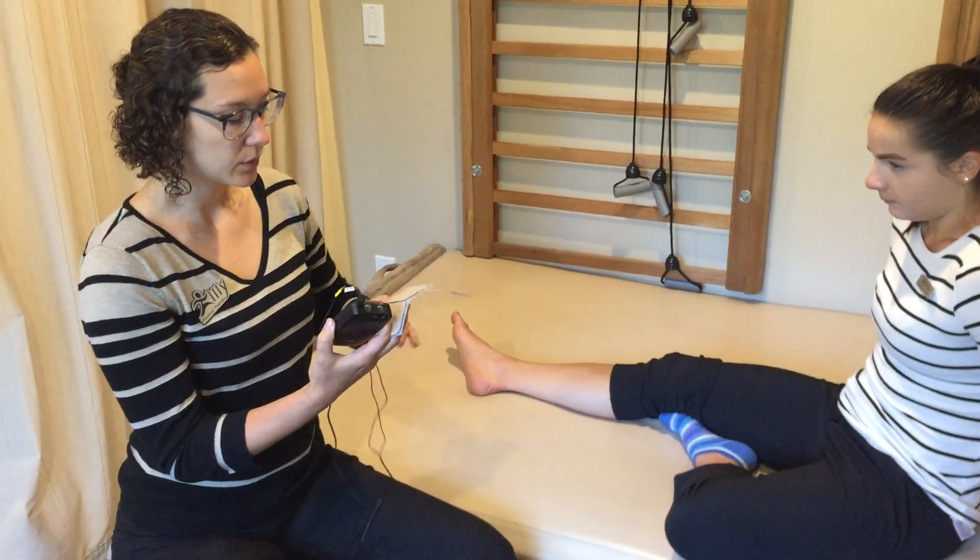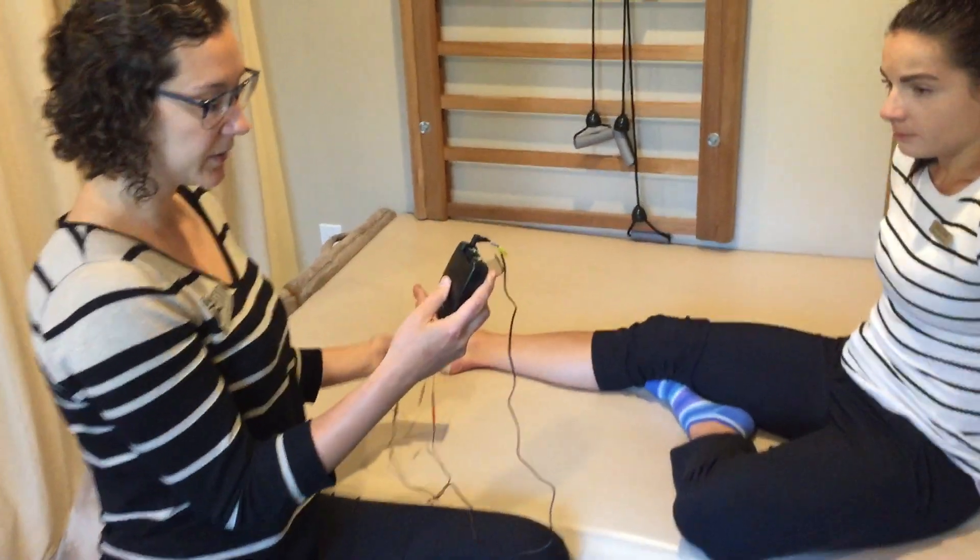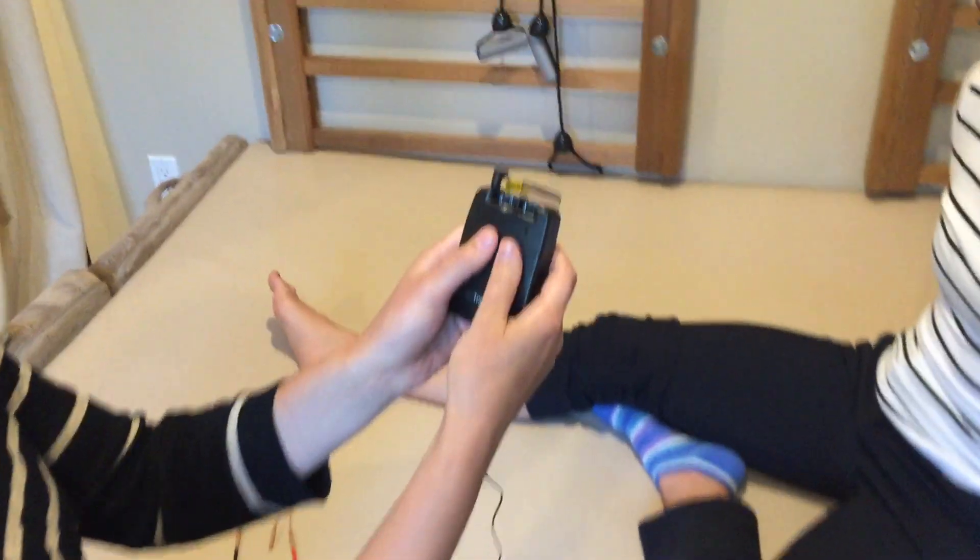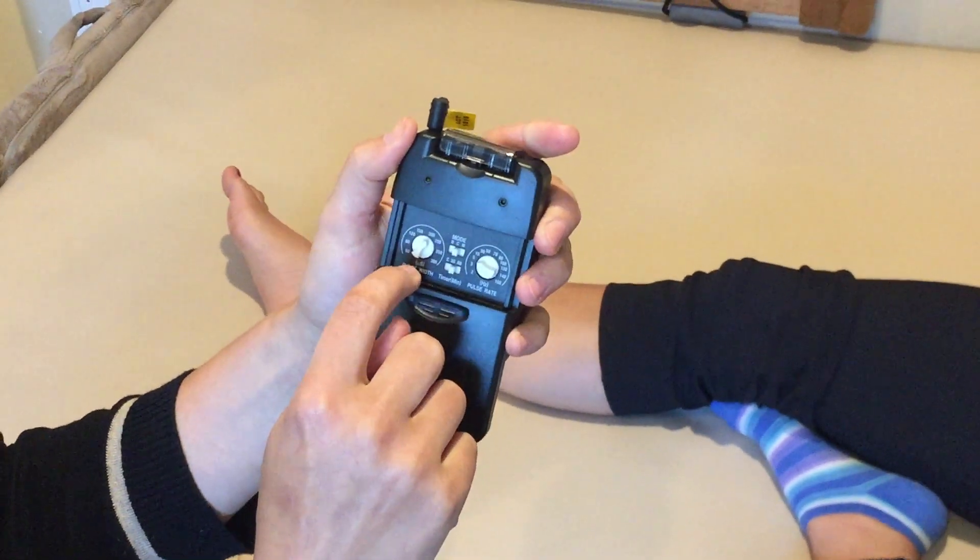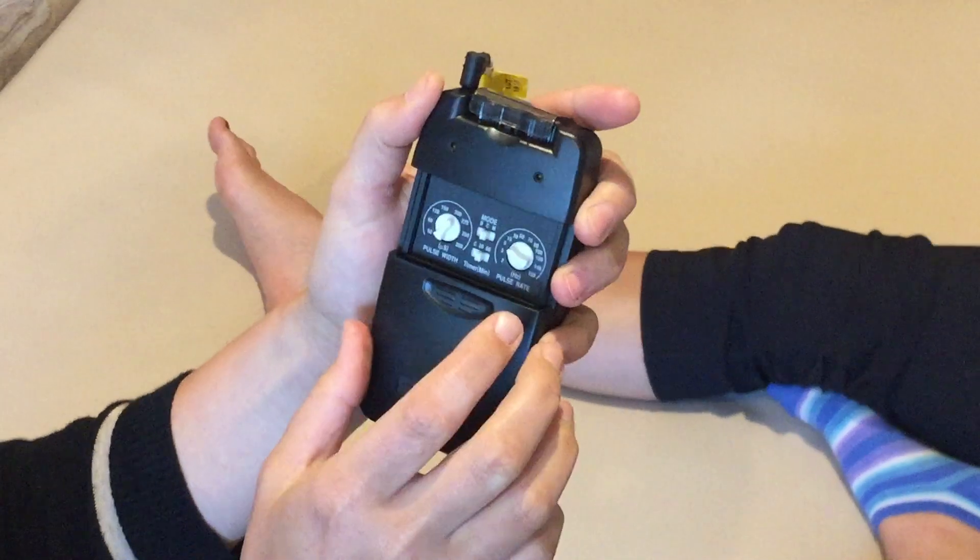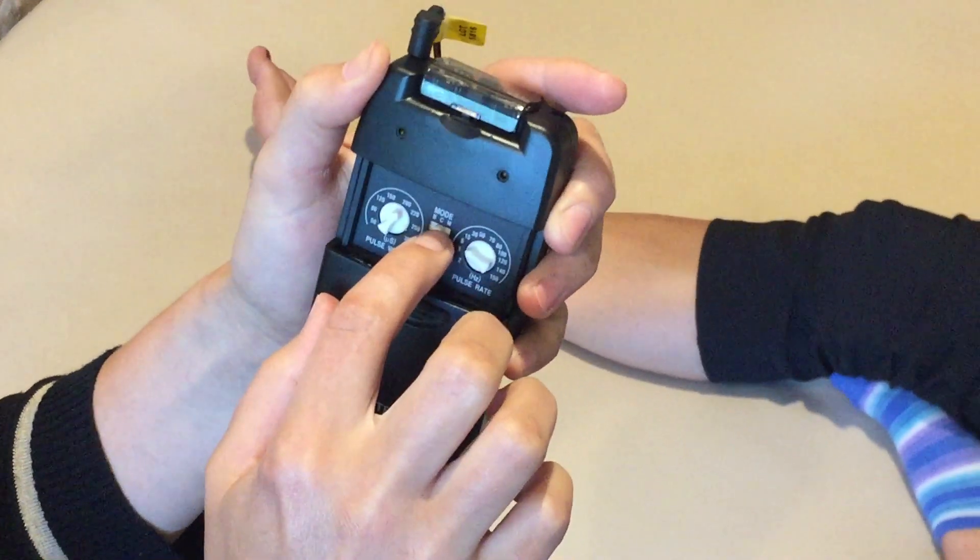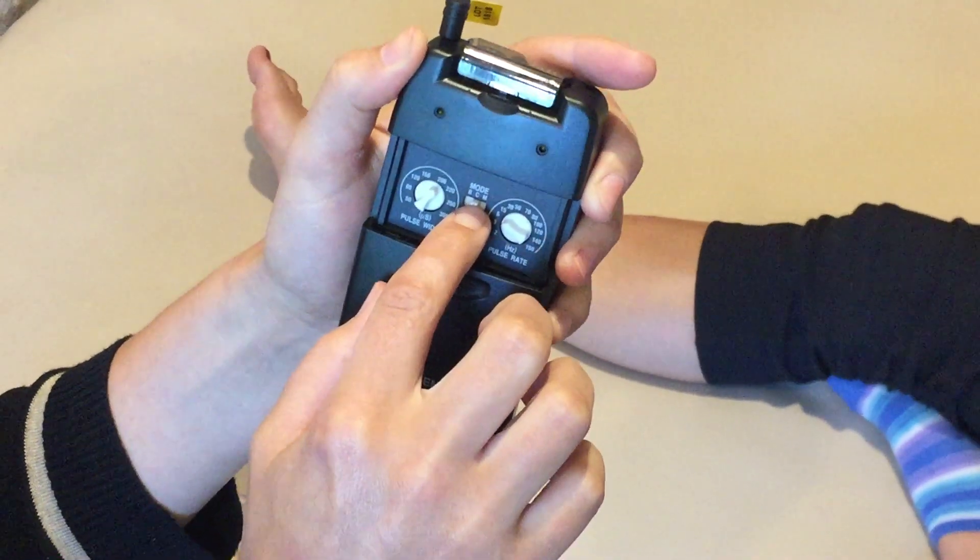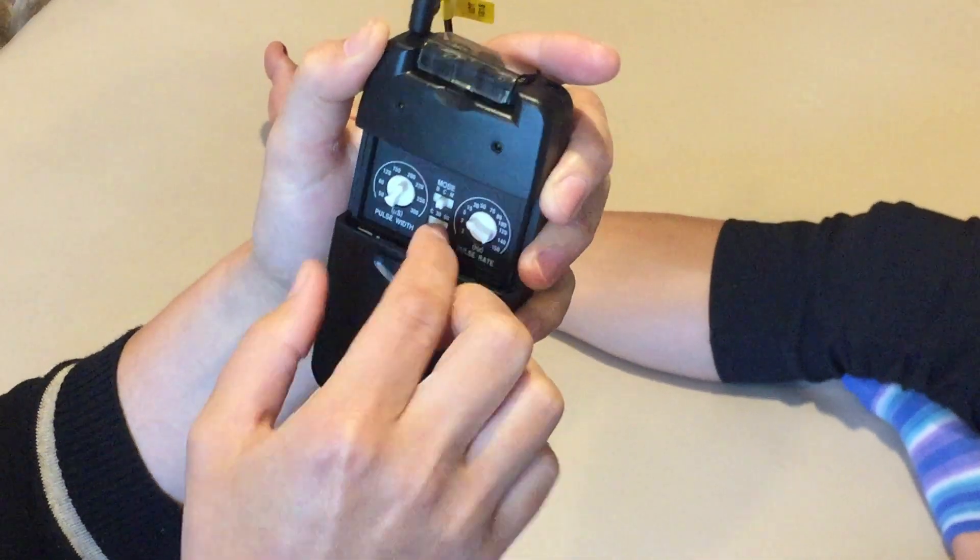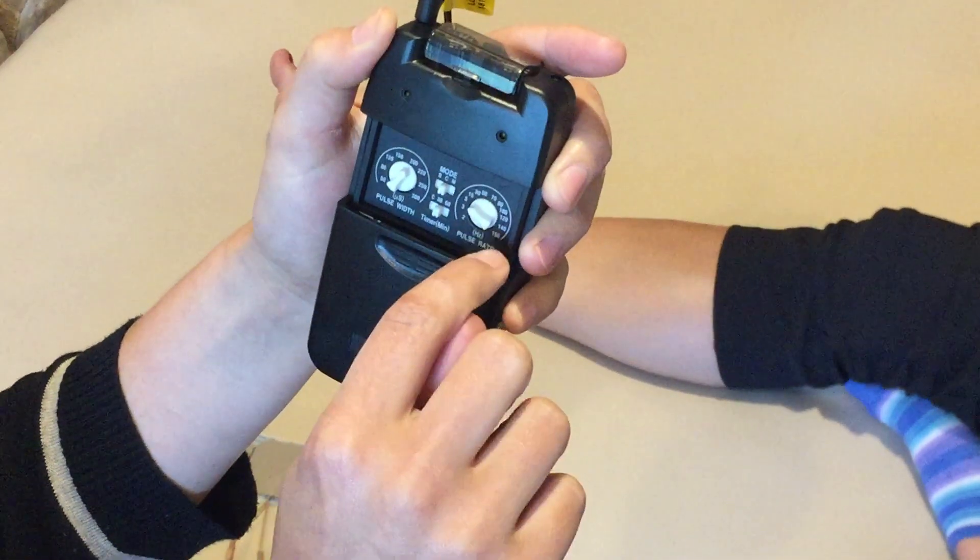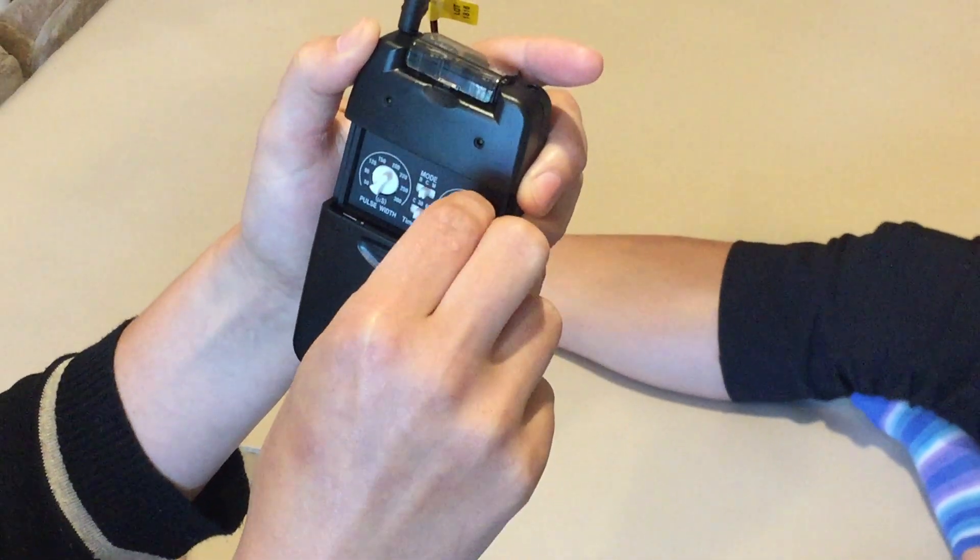So we'll start by setting the parameters on our TENS unit here. If we flip this compartment down you can see pulse width should be at 200 microseconds. Mode you want to be on C for continuous. Timer you can set it to 30 minutes and pulse rate should be at 5 Hertz.